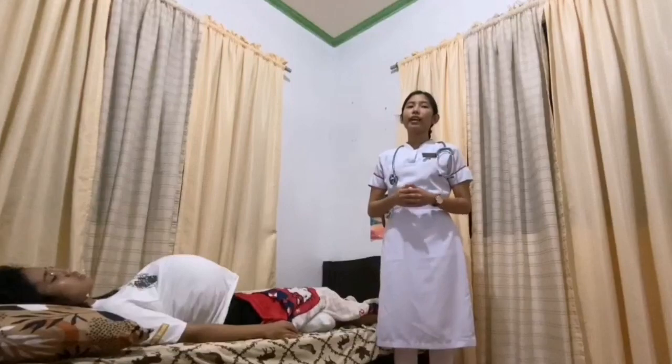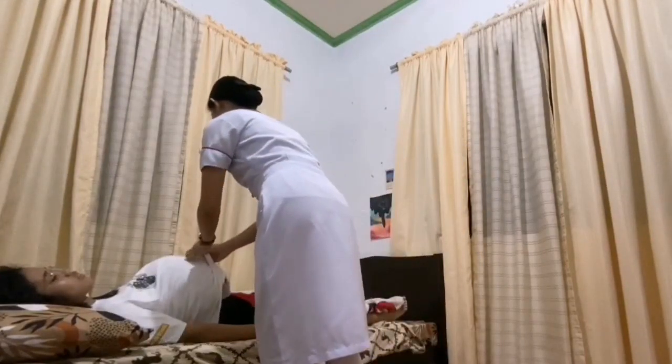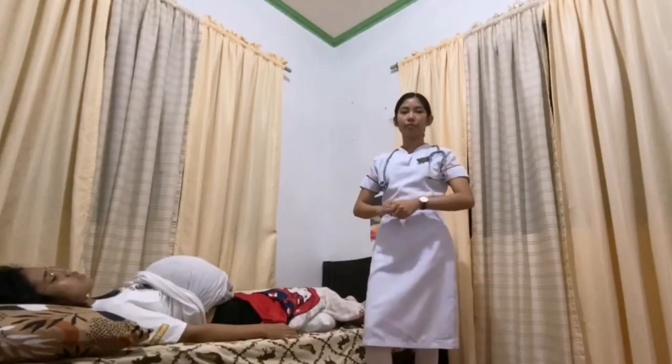Then, let the client lie down on a soft surface and expose her abdomen for easy accessibility to the client's abdomen by the healthcare provider. After that is to feel the client's stomach and try to locate the baby's back. The midline is generally a good place to locate the fetal heart sound.